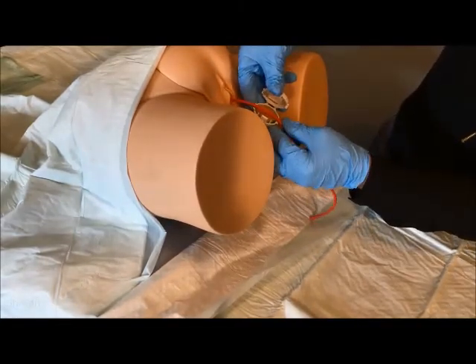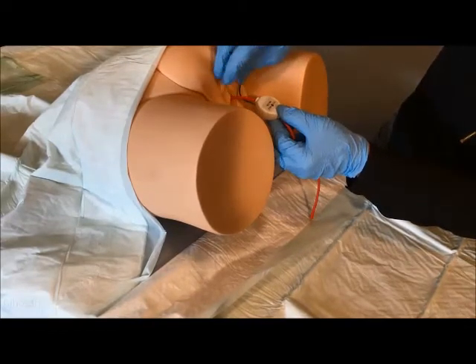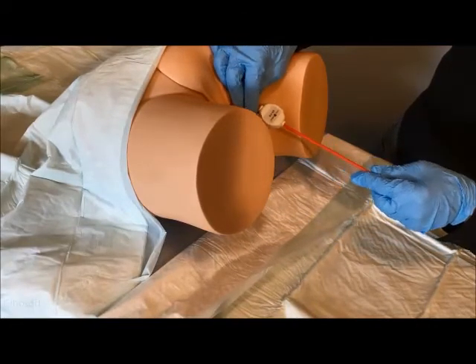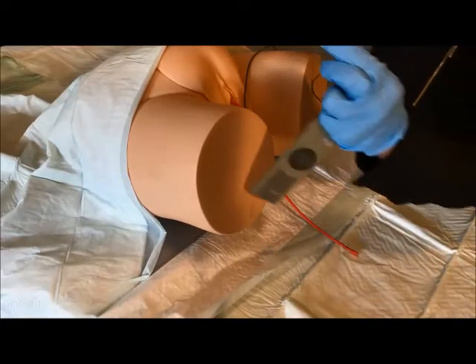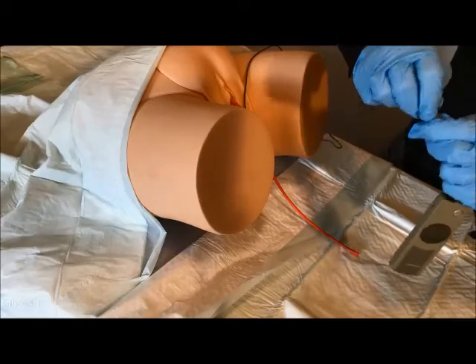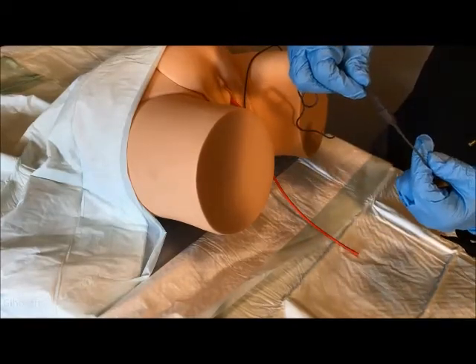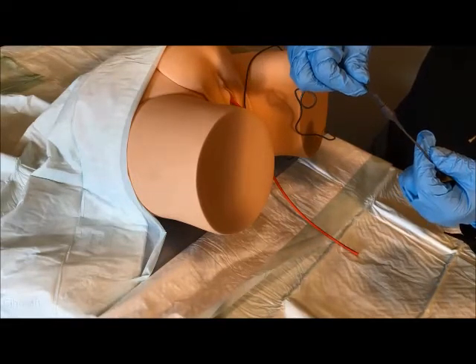Carefully close the actuator so that the two halves have snapped together, making sure the catheter is not pinched or deformed at either end of the actuator. Then insert the actuator plug into the driver cable socket, making sure to orient the plug correctly in relation to the socket and that the plug is fully inserted.